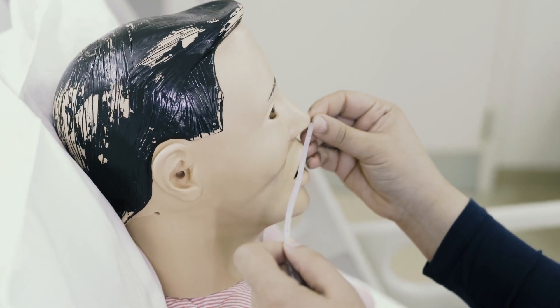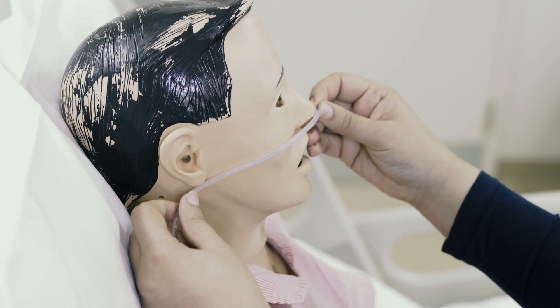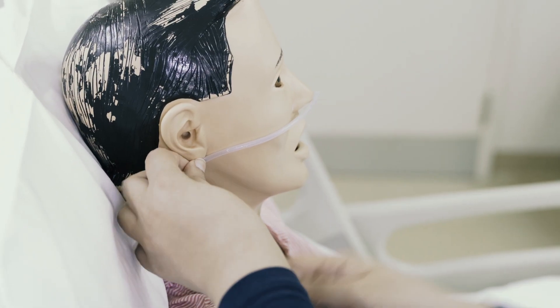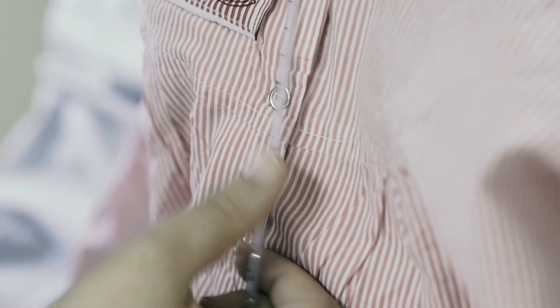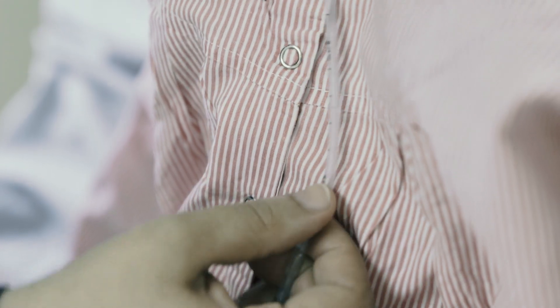Measure the length of tube needed for insertion from the bridge of the nose to the ear lobe to the bottom of the xiphoid process. Then mark the required length of insertion.